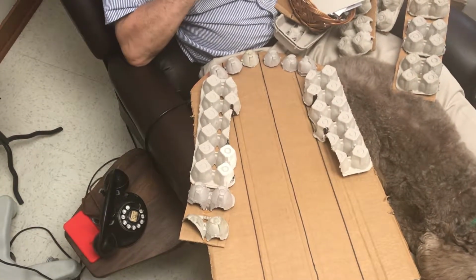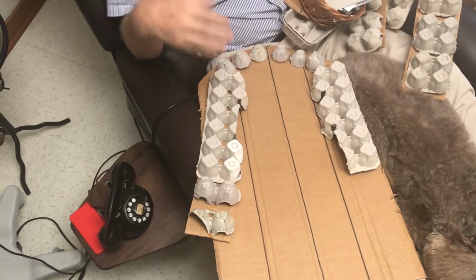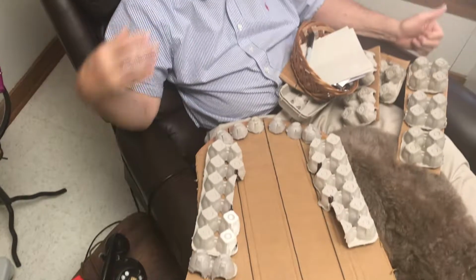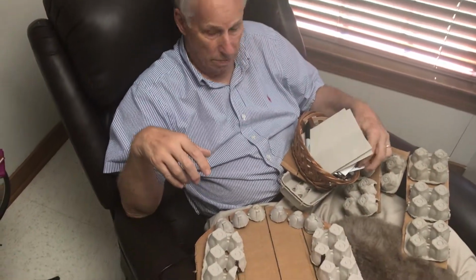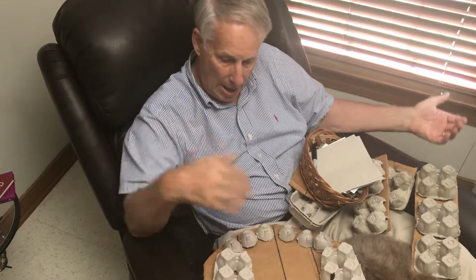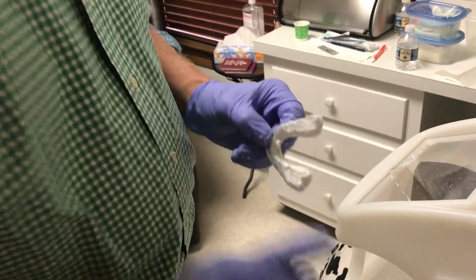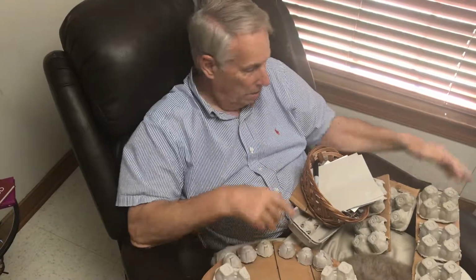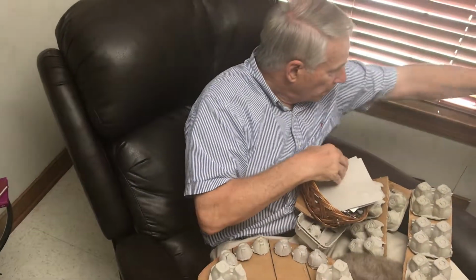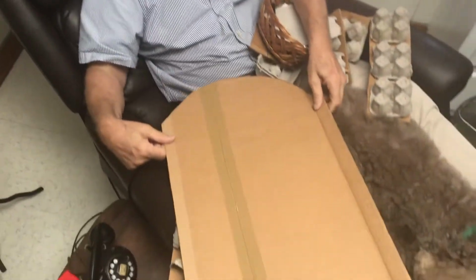So we're facilitating the tongue getting up from a position that's keeping the base of the tongue in the back of the throat. We have and will have a lot more to say about the tongue, but you have to have the picture that with some PIP, and you put it on the tongue side and on the top of the appliance, you will see how that tongue is moving over the teeth, and you'll be able to guide the tongue back into the proper position, which is really laying on top of the teeth and covering a little bit of the front teeth.